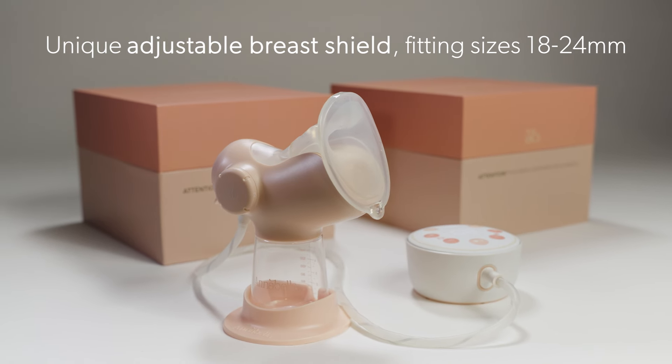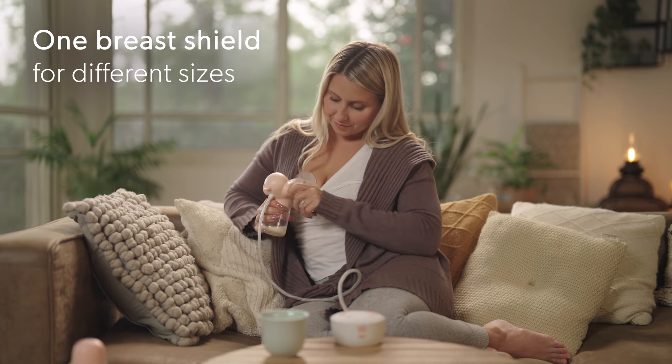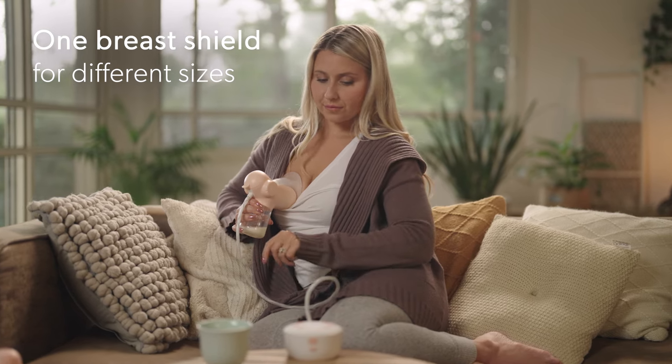Annabella offers a wide range of sizes from 18 to 24 millimeters, all in one breast shield. The best part is that you can adjust the breast shield to different sizes throughout your entire breastfeeding journey, without having to buy additional breast shields.